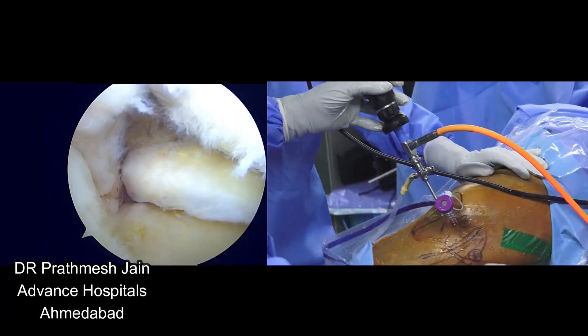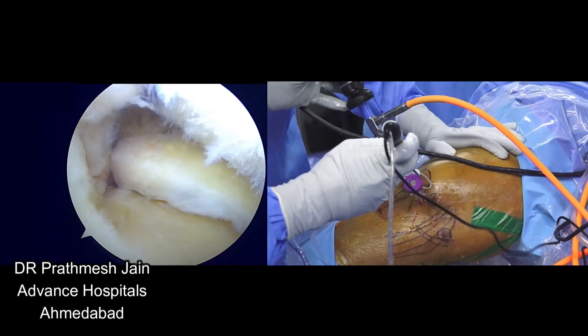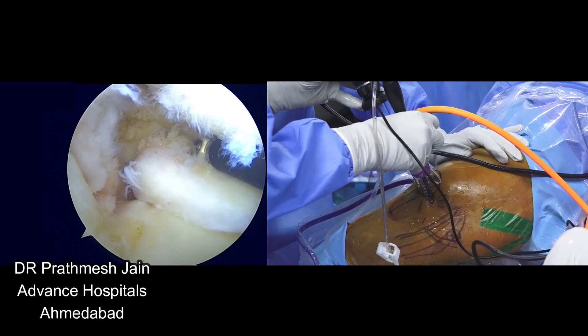My exposure on the back, so I may use a little bit more RF and release the posterior part a little bit more RF please.